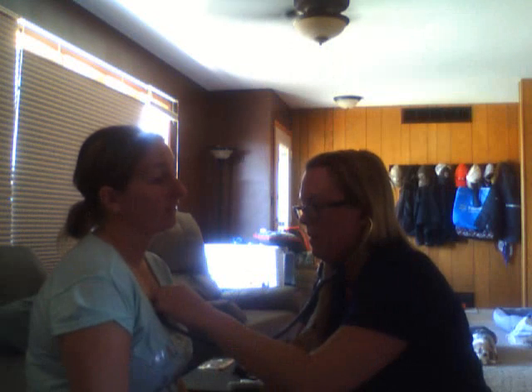Okay, the apical pulse, the rate and rhythm is normal. All right. And now I would check with the bell and diaphragm of the stethoscope. I would be checking the A, P, E, T, and M. We can try to do that. I don't know how successful we will be.